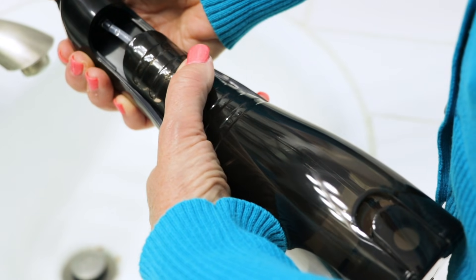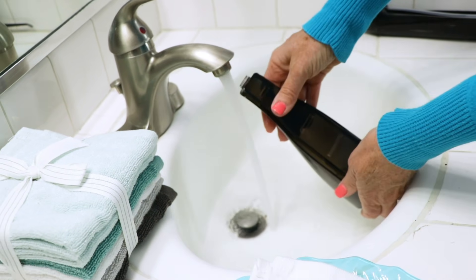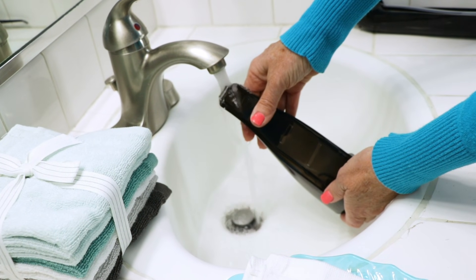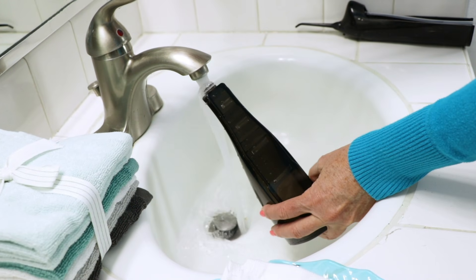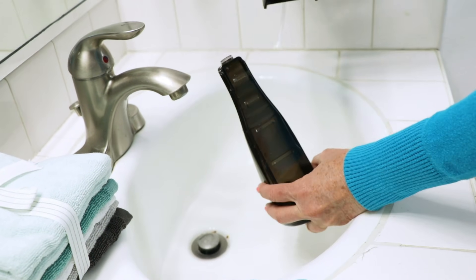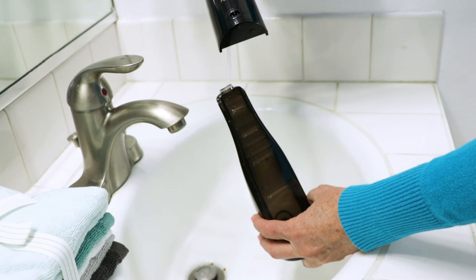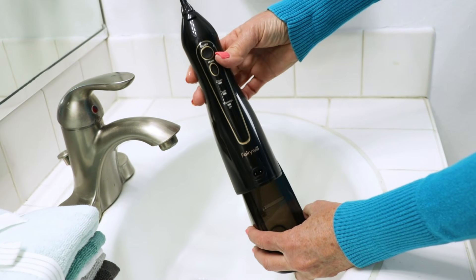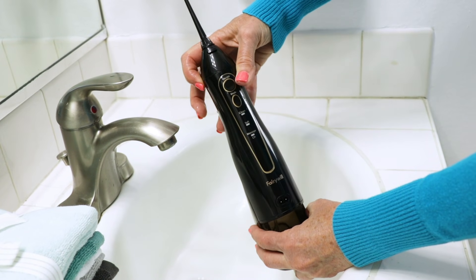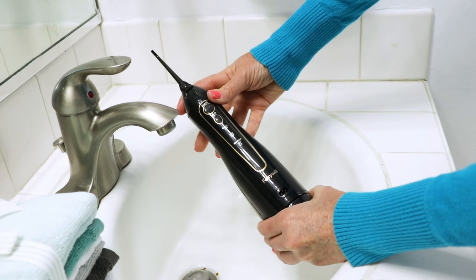The base is easy to open because of the finger grips on it. I like to fill it with medium warm water so the temperature matches my own mouth, because my teeth are so sensitive. I fill up the tank and put back in the plastic nozzle that brings the water up into the flosser. It goes all the way down to the bottom so you can use every last bit of water without refilling — that's two minutes worth. Snapping it back in was a breeze.